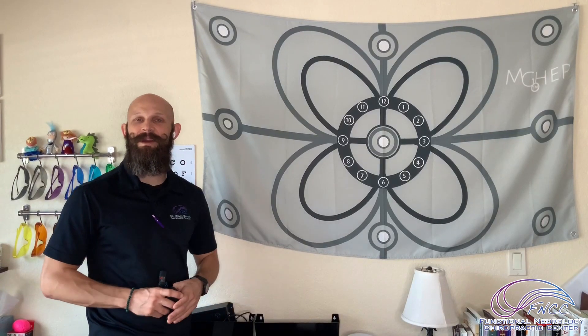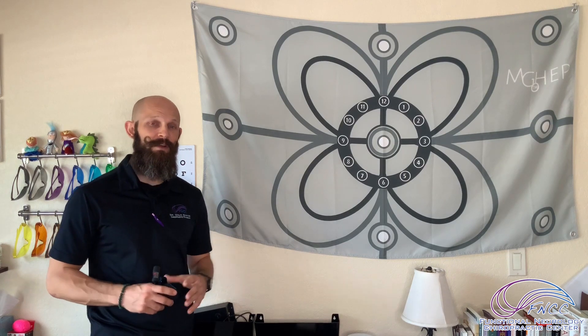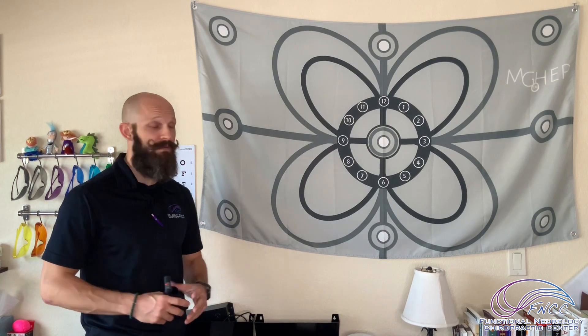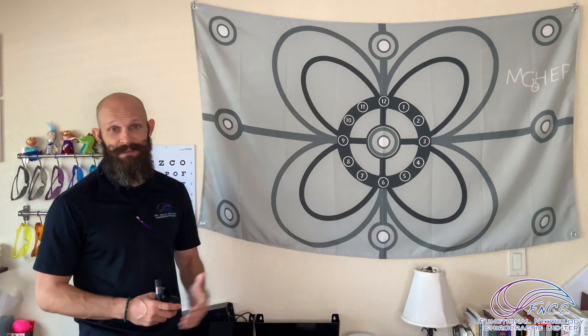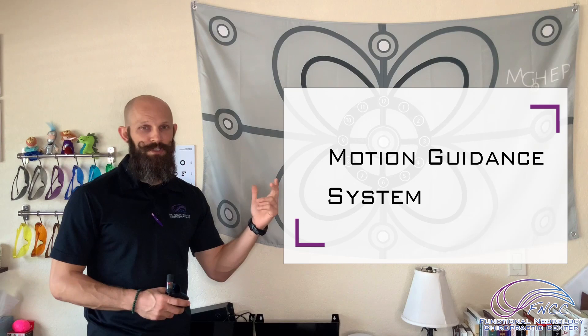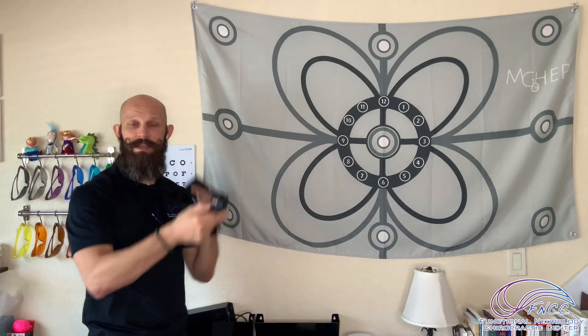Hey everybody, Dr. Colin Bartow here with the Functional Neurology Chiropractic Center. In today's video we're going to show you another one of the modalities that we use to treat patients. The flag is kind of the center of this video — let's talk about this. This is part of our motion guidance system, combined with this laser right here and this strap.